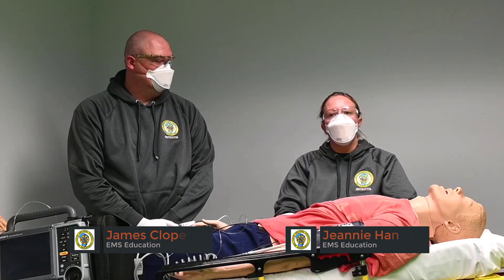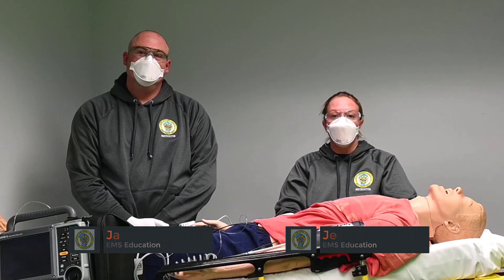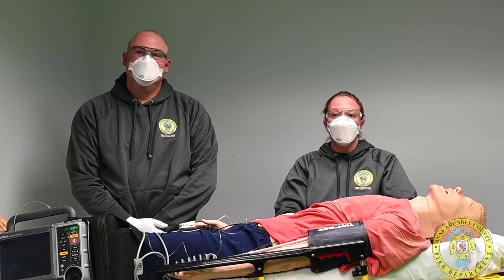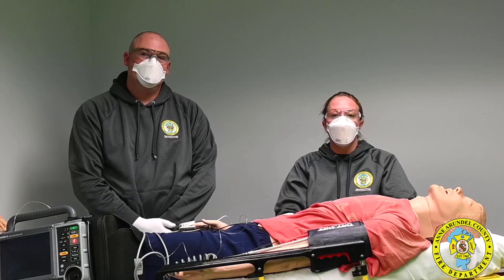Hey everybody, it's Jeannie and Jimmy. Here in EMS training we're constantly trying to come up with new ways to keep you protected during this COVID-19 pandemic. Something that was brought to us by an awesome field paramedic, Kevin Schoeff, was the use of a poncho for airway management.